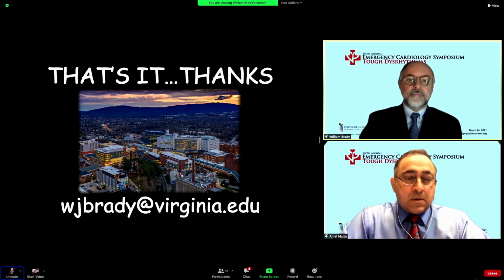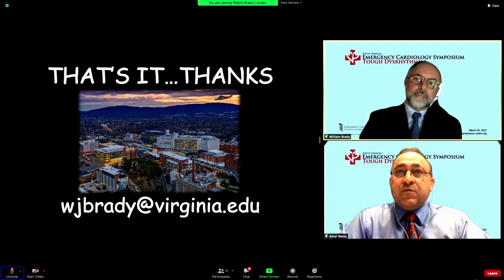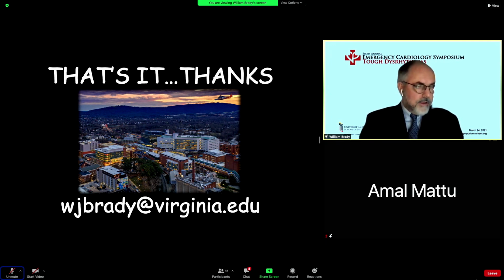That was a really fantastic talk. I think we have a few minutes for questions, and then we'll take our break. So let me hand things over to Sarah and Cheyenne for a couple of questions that have come up on the chat. Okay. Thank you, Dr. Brady. So first question for you is: is there any way to increase the sensitivity of the EKG in capturing AV dissociation, fusion beats, or capture beats?